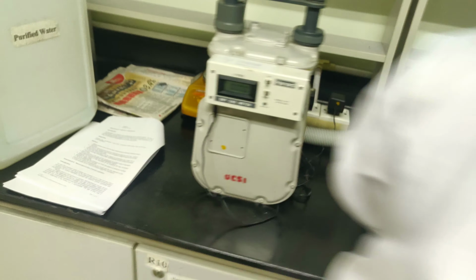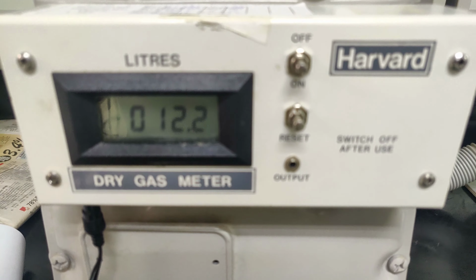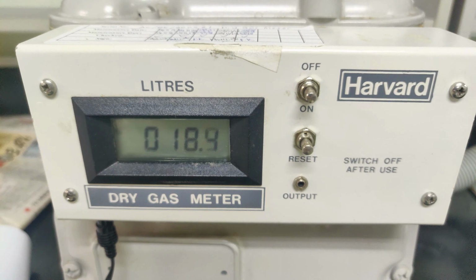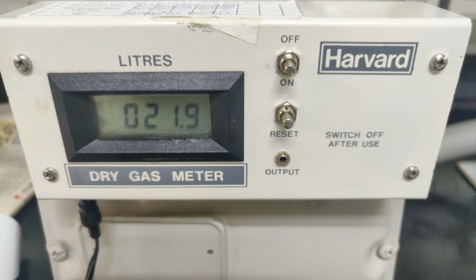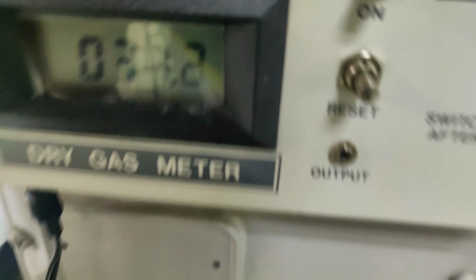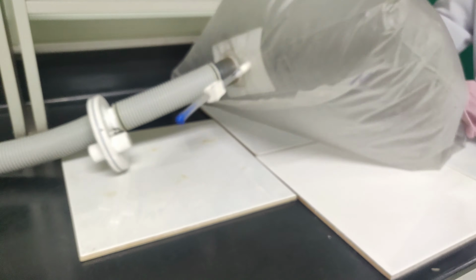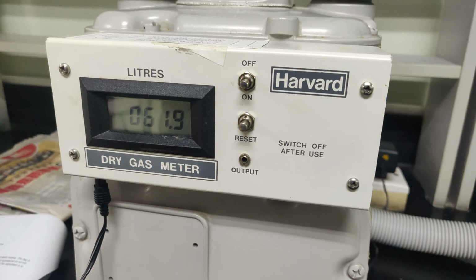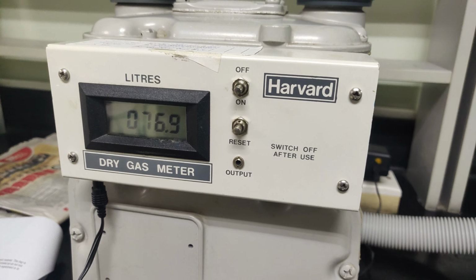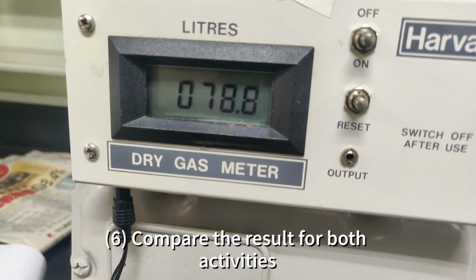And then we're going to do the same thing. We need to press down the bag, and then we're going to see the volume of the air collected through the gas meter. As you can see, we expected that the volume should be much higher than the previous one. Okay, so this is the final reading, 78.8 liter.